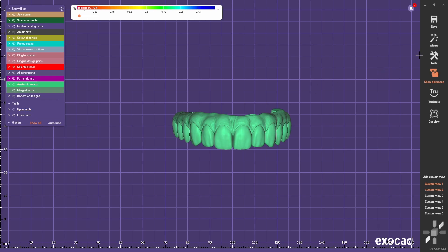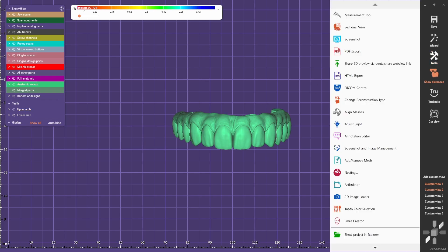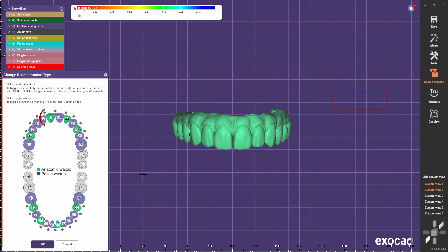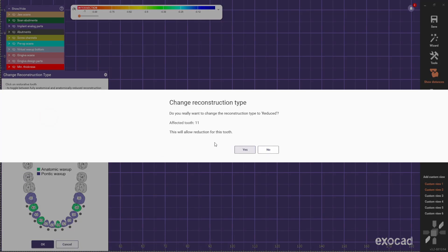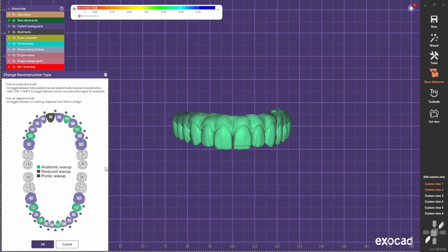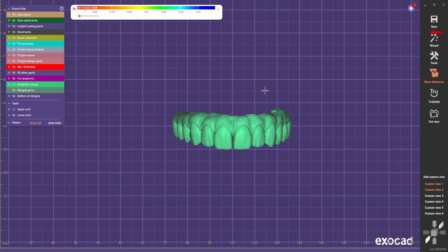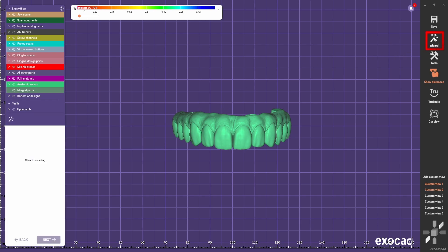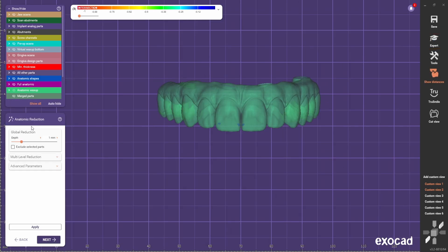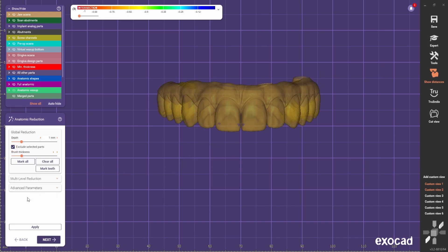After that, go to tools and change the reconstruction type to reduced, because this one is full contour and now we want to reduce the structure. Click yes — you only need to select one of them and press OK. Now go to wizard and we have the anatomic reduction part. Go to the exclude — select part.